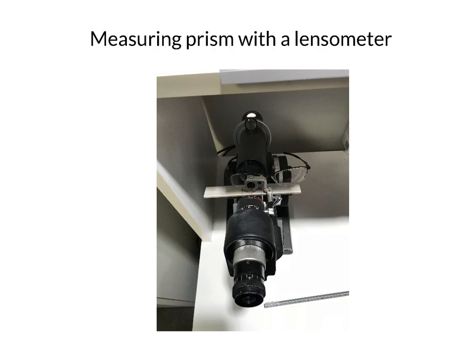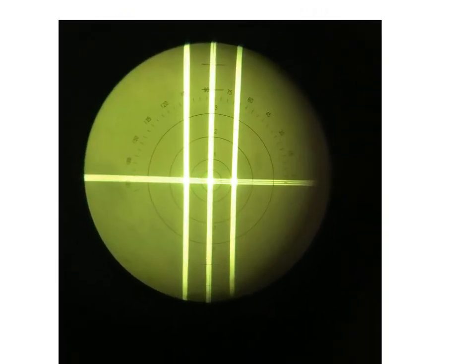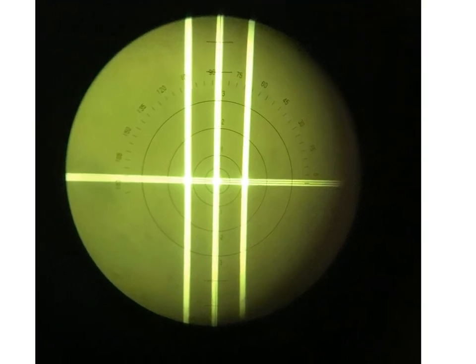When you look inside a lensometer, when you look through this eyepiece, you see a target. Here there is no prism, so the target is centered in the middle.